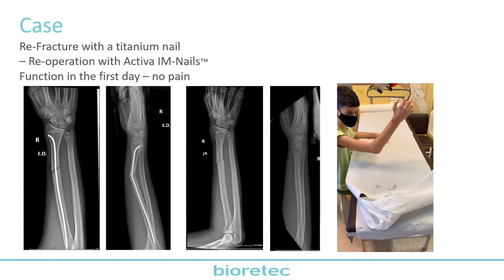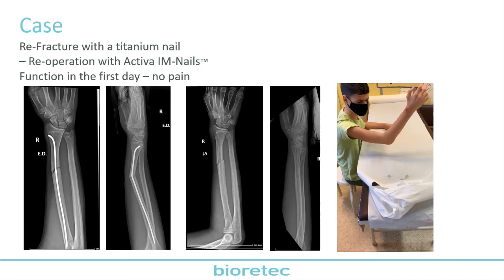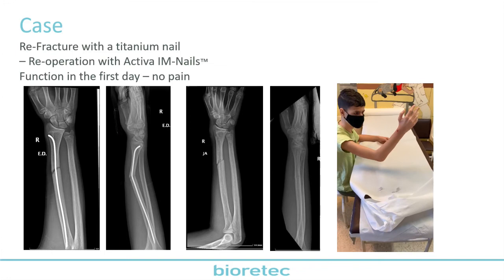And again, a very special case. It was a refracture. Even a refracture can occur when the titanium nail is still inside. And we removed the nail and we replaced this nail with an IM nail. I think it is really a very special case. We have stabilized the ulna as well, because we have seen a small bending of the ulna. And the forearm was stabilized with 3.3 millimeters, so the thickest IM nail.